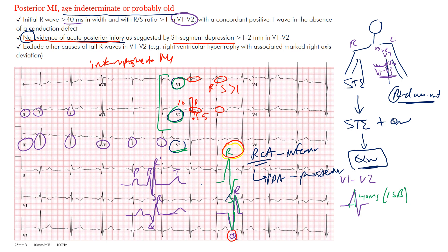You also want to exclude other causes of tall R waves in V1 and V2. Right ventricular hypertrophy is a diagnosis of exclusion, but notice there's no right axis deviation — the QRS axis here was about 3 degrees, within normal limits. If you saw right axis deviation you might want to rethink the diagnosis. In this case, the patient had a previous inferoposterior MI, and those R waves represent Q waves in the right precordial leads indicating posterior involvement.